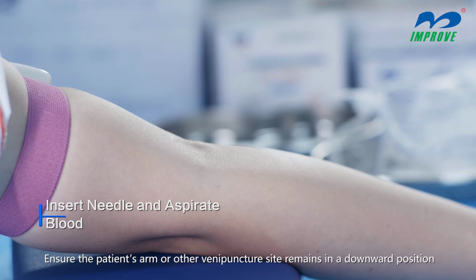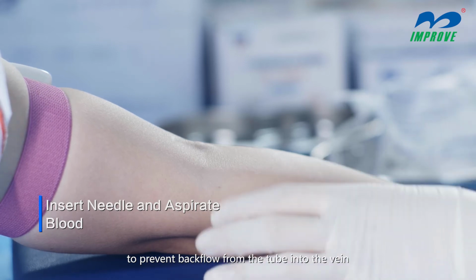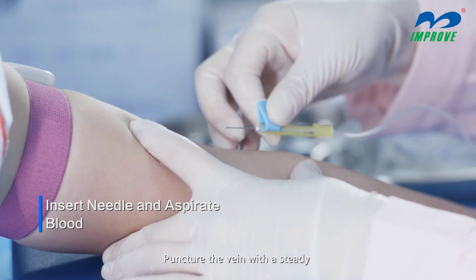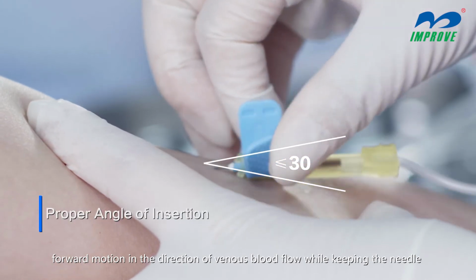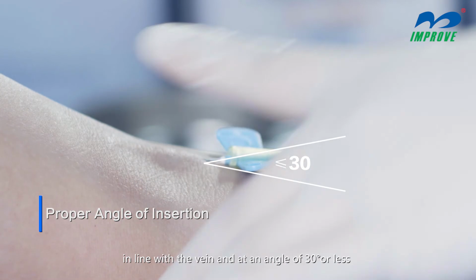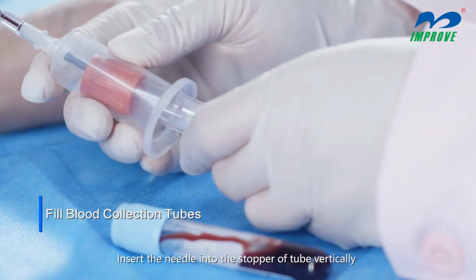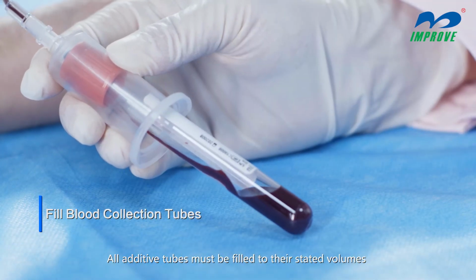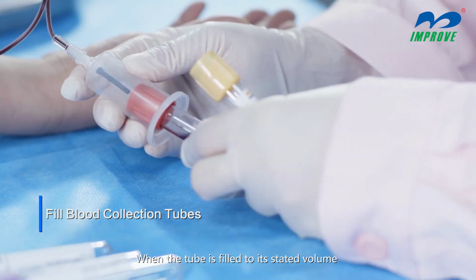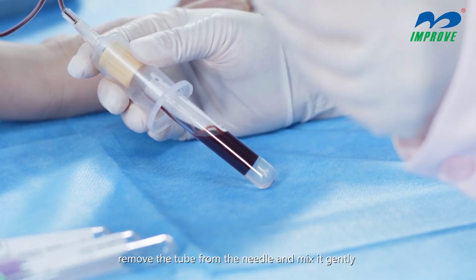Ensure the patient's arm or other venipuncture site remains in a downward position to prevent backflow from the tube into the vein. Puncture the vein with a steady, forward motion in the direction of venous blood flow while keeping the needle in line with the vein at an angle of 30 degrees or less. Insert a needle into the stopper of the tube vertically. All additive tubes must be filled to their stated volumes. When the tube is filled to its stated volume, remove the tube from the needle and mix it gently.